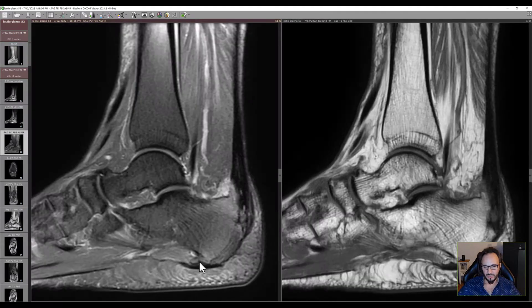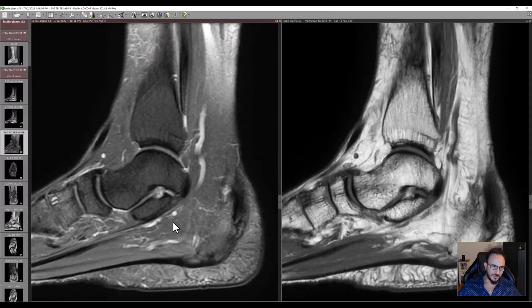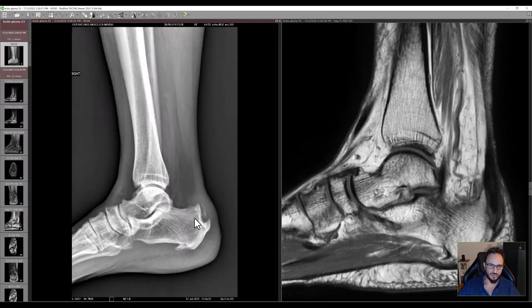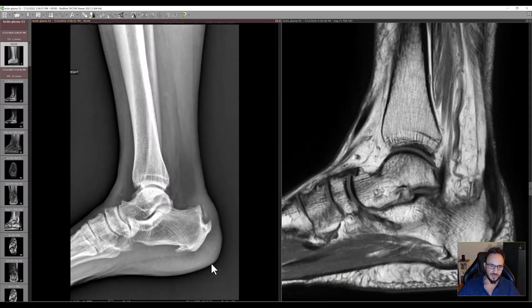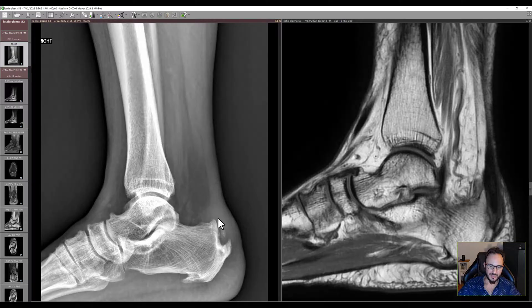At the origin of the plantar fascia. Maybe I should show you the X-ray. Of course we did the X-ray after the MRI, so now you can really appreciate the extent of bony changes. And these calcifications are inside the tendon.